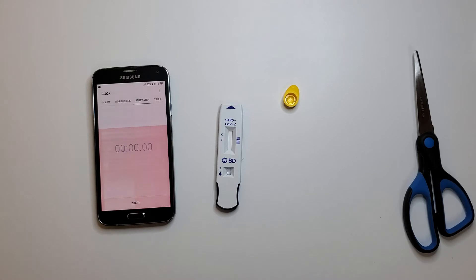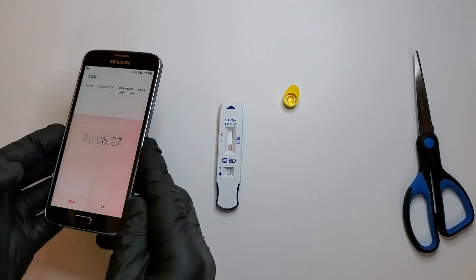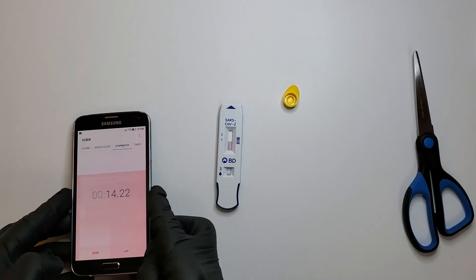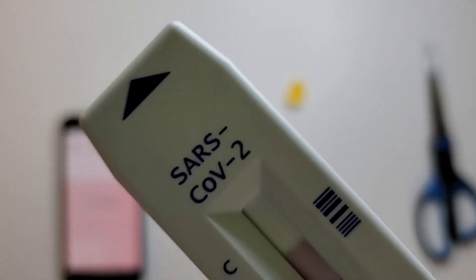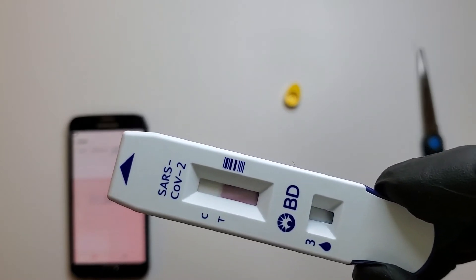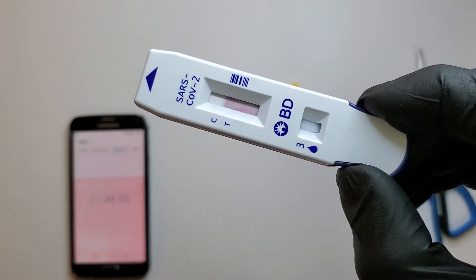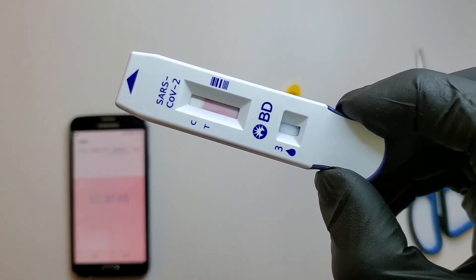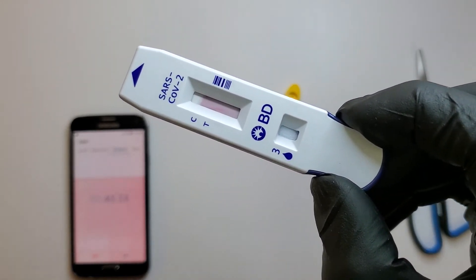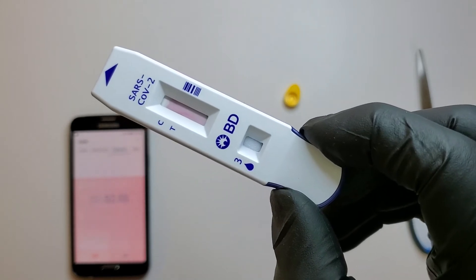Let's set our timer. The timer is going — 15 minutes — and look at it, the color is showing that it's absorbing the liquid. Look at it, it's absorbing it. So let's see what happens. In 15 minutes it will detect whether or not I am positive or negative for SARS-CoV-2.